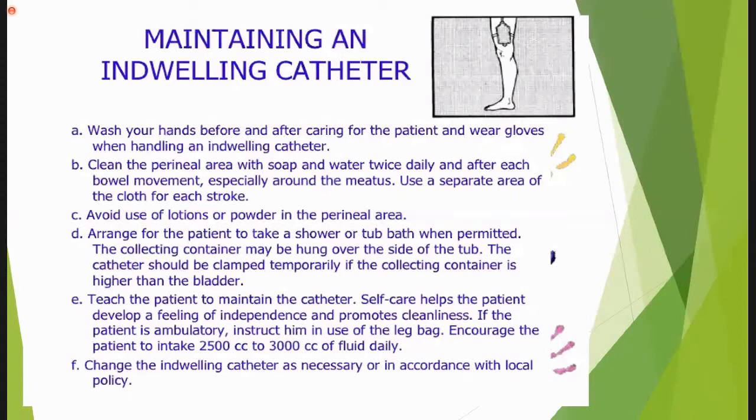If it is fixed, then attach the urine bag with the catheter, and at the end of both procedures, whether male, female, or children, you have to document each and everything.